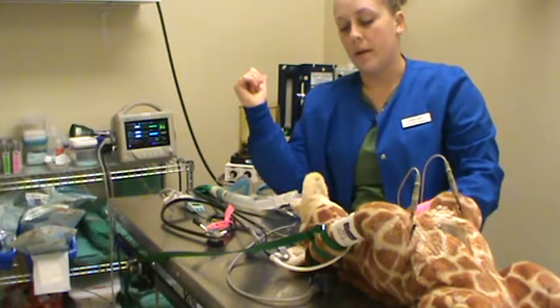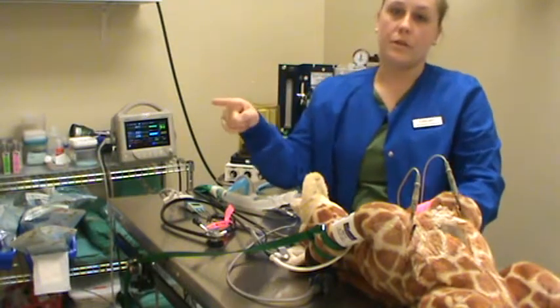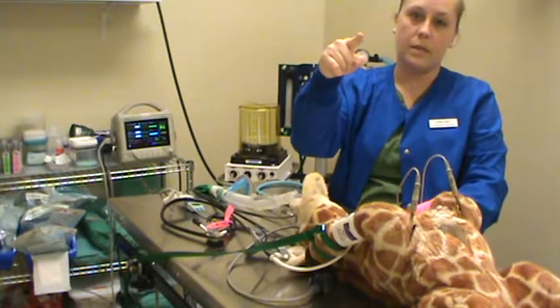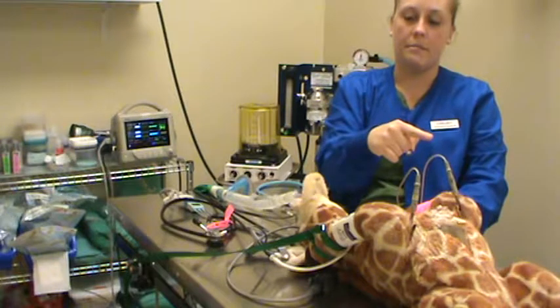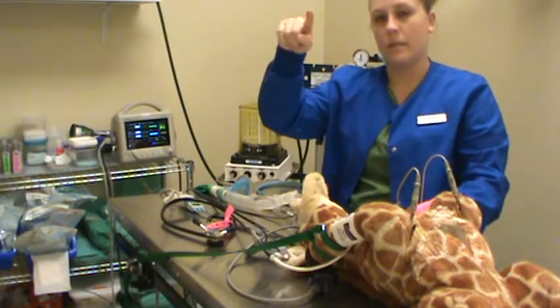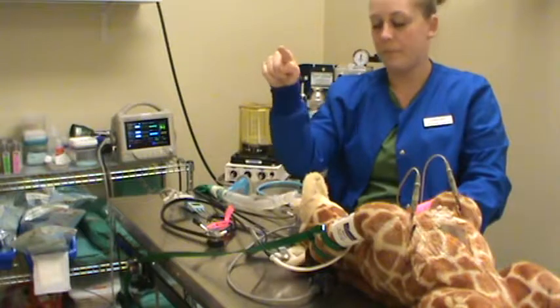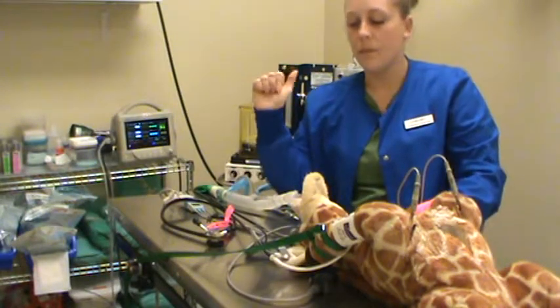So that number needs to be about anywhere from 37 to 40. So we're going to draw a little line. It's going to go up, plateau when you exhale, and come down, and then have a little valley. Let's go up again and exhale, and then down to a little valley. So the peak is at our height of exhalation, which should be about 38 to 40. So that's our value of end tidal CO2.